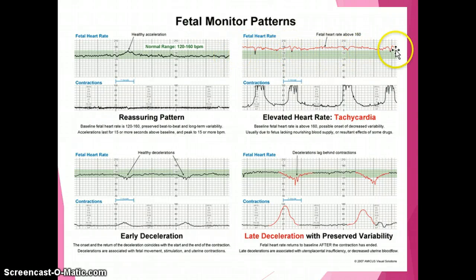This pattern can be called fetal tachycardia — the baseline fetal heart rate is consistently above 160 beats per minute with possible onset of decreased variability, as you don't see many bumps or jags. It's typically due to the fetus lacking adequate blood supply or nourishment. Causes include maternal use of illicit drugs or medications like terbutaline, which can elevate and cause fetal tachycardia, so you need to find out what the mother has taken.